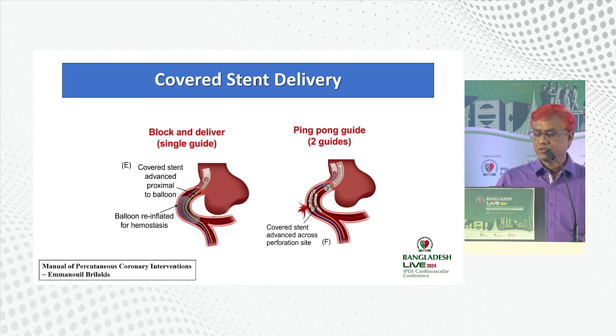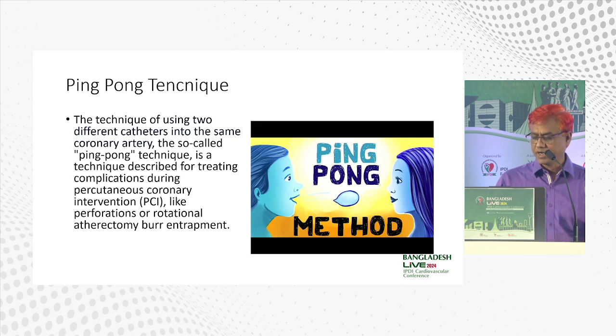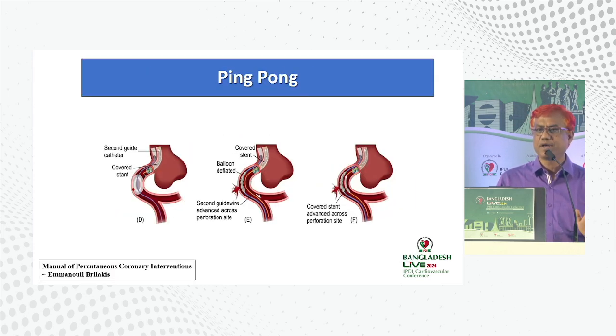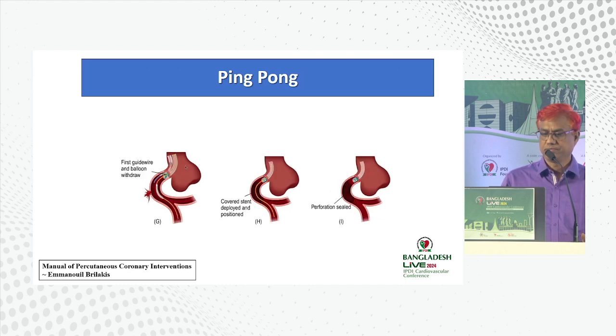In the two guide system, that is the ping pong technique, one guide delivers the balloon and one guide delivers the stent, and the procedure is the same. When the stent is deployed, you must withdraw the first balloon containing wire and balloon. This is the ping pong technique.